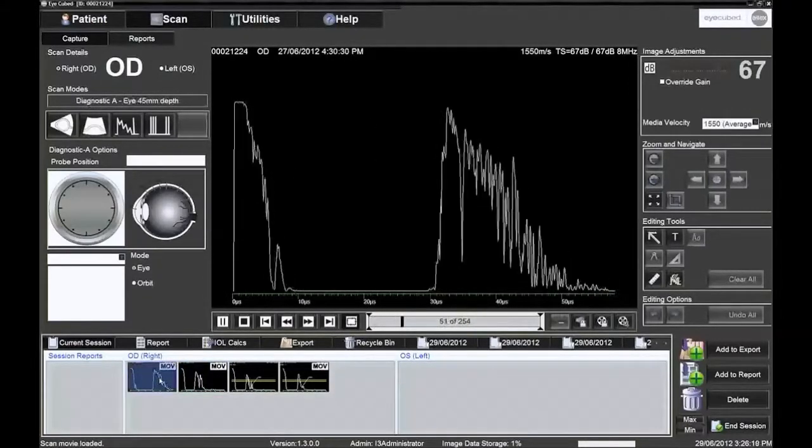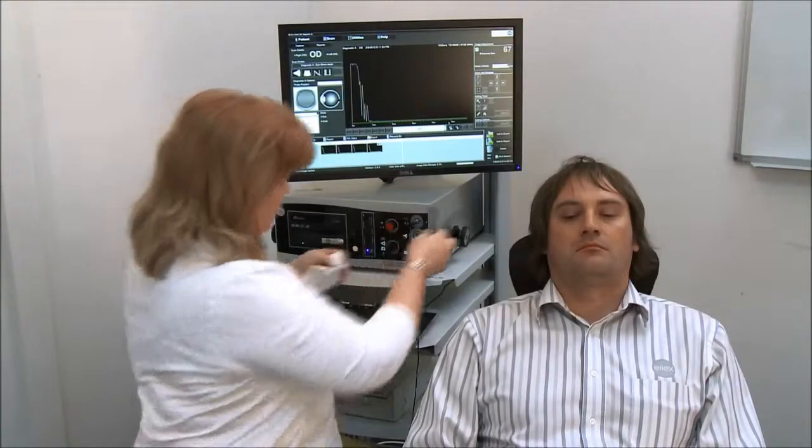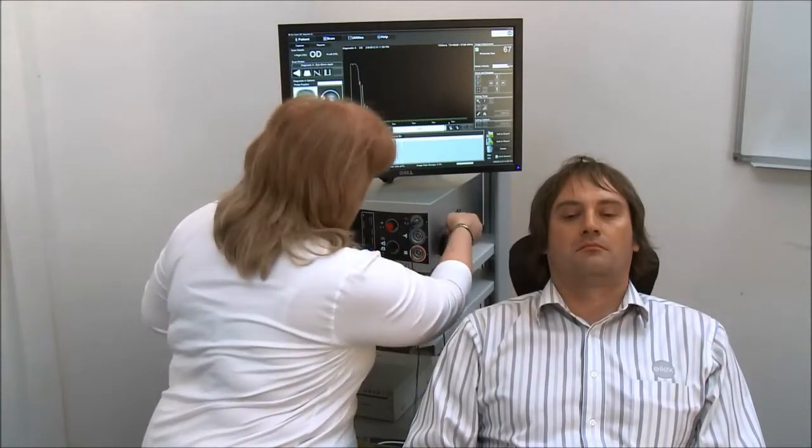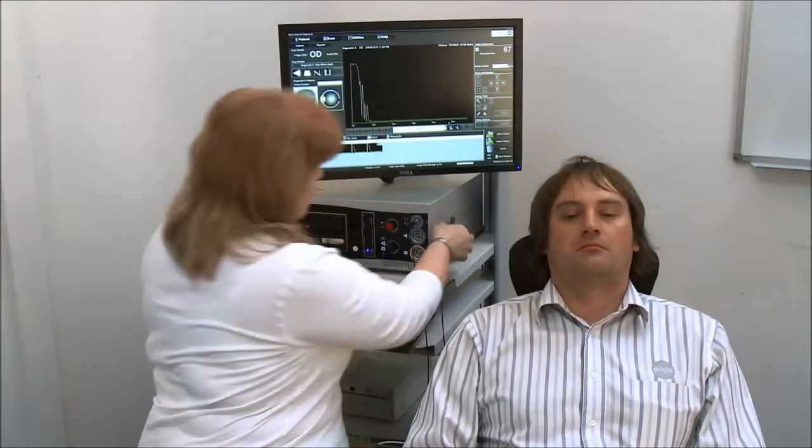As soon as patient examination is complete, clean the probe and place upright in the probe holder.